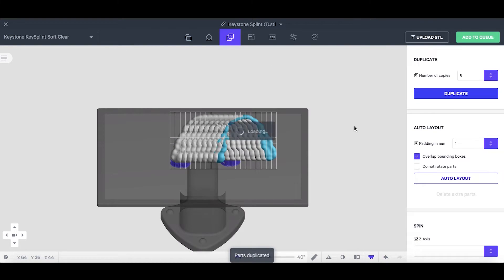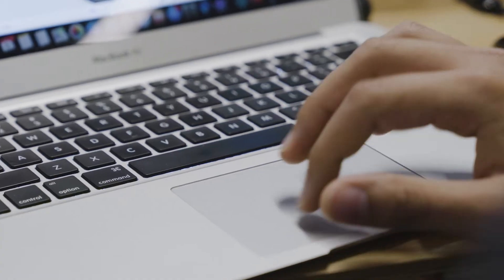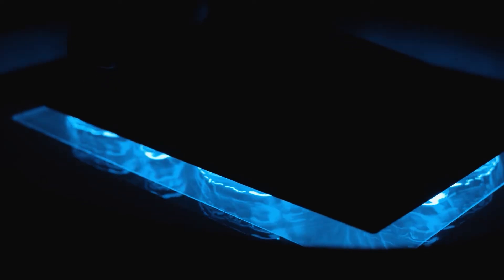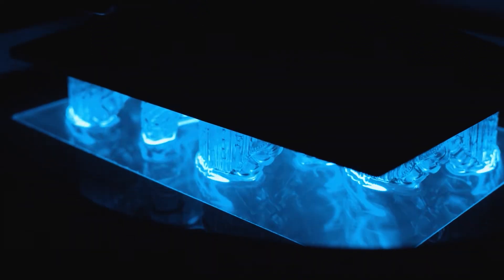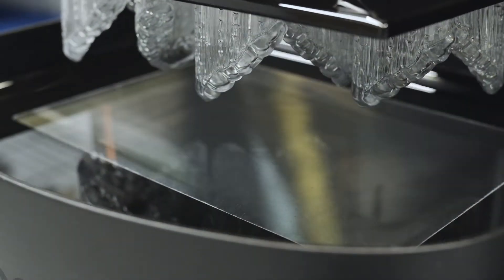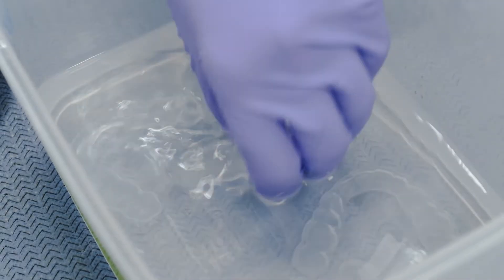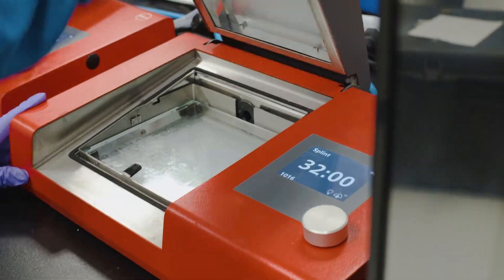The Carbon 3D printer uses digital light synthesis technology to continuously build the night guard. The DLS method, formerly known as continuous liquid interface production, is an improvement to the typical photopolymerization techniques. The printer uses UV light to cure the appliance that is being printed.